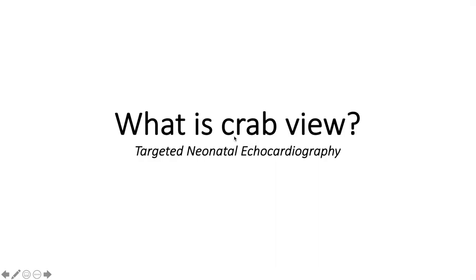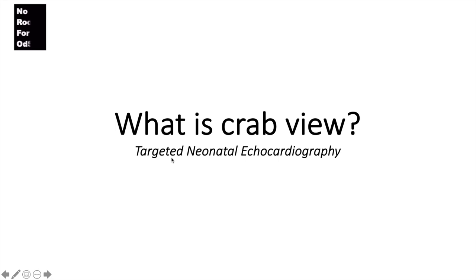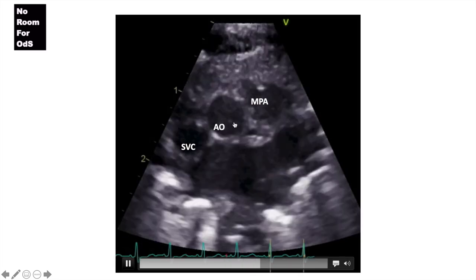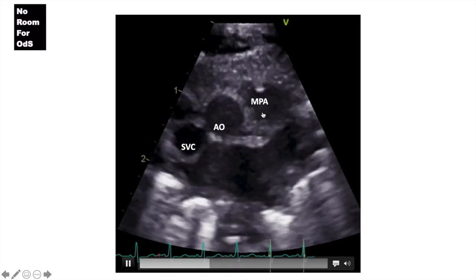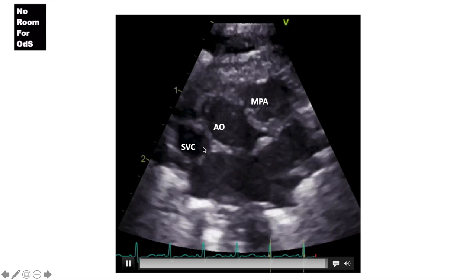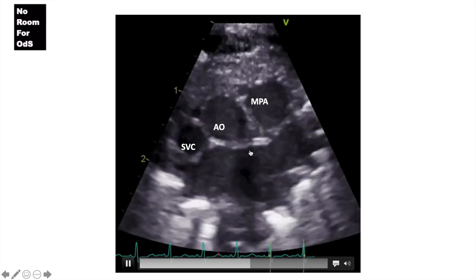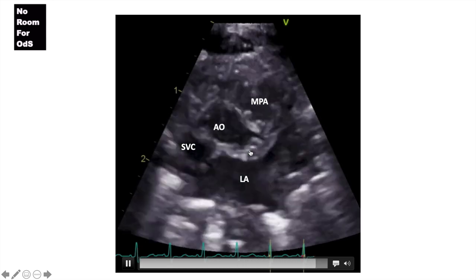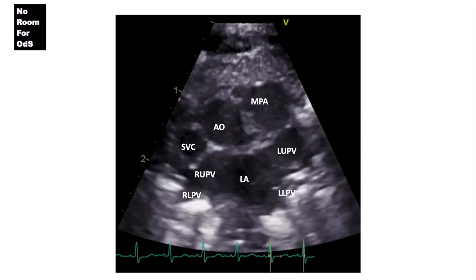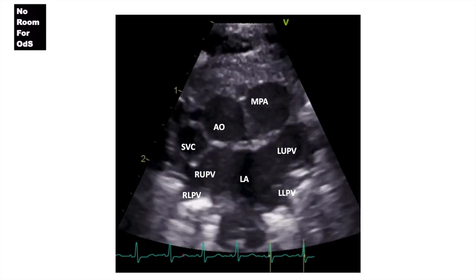Today I'm going to show you the crab view, which is an important view that we get as part of the TNE protocol. You can see that you're right here in the middle between the pulmonary artery and the superior vena cava. At the bottom is the left atrium, and you can see the four pulmonary veins draining into the LA.